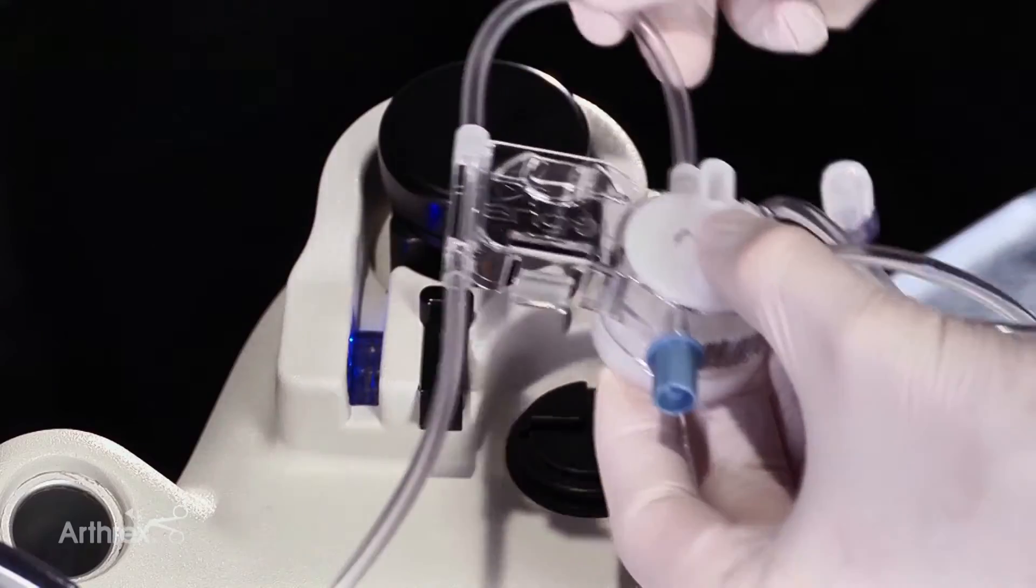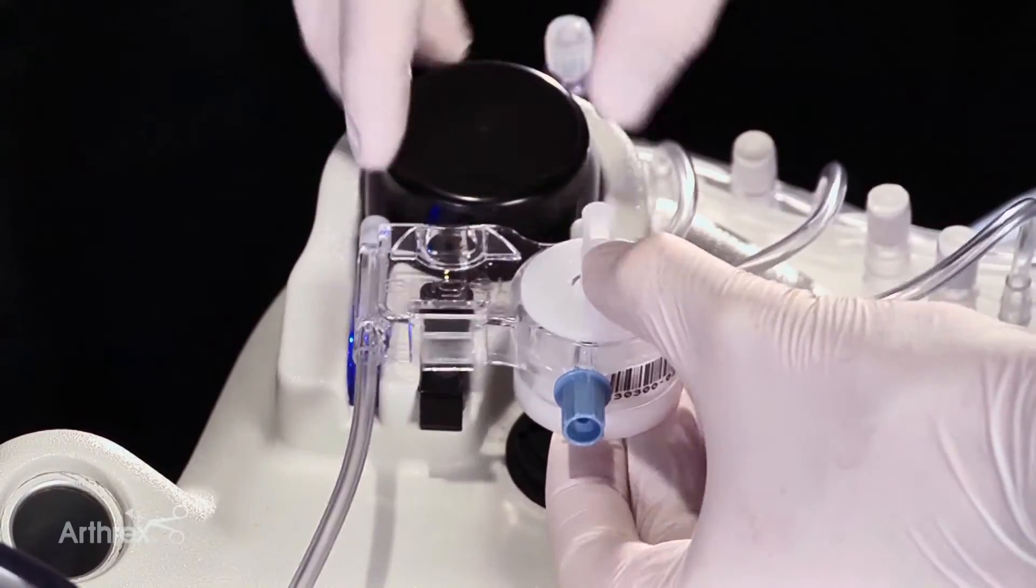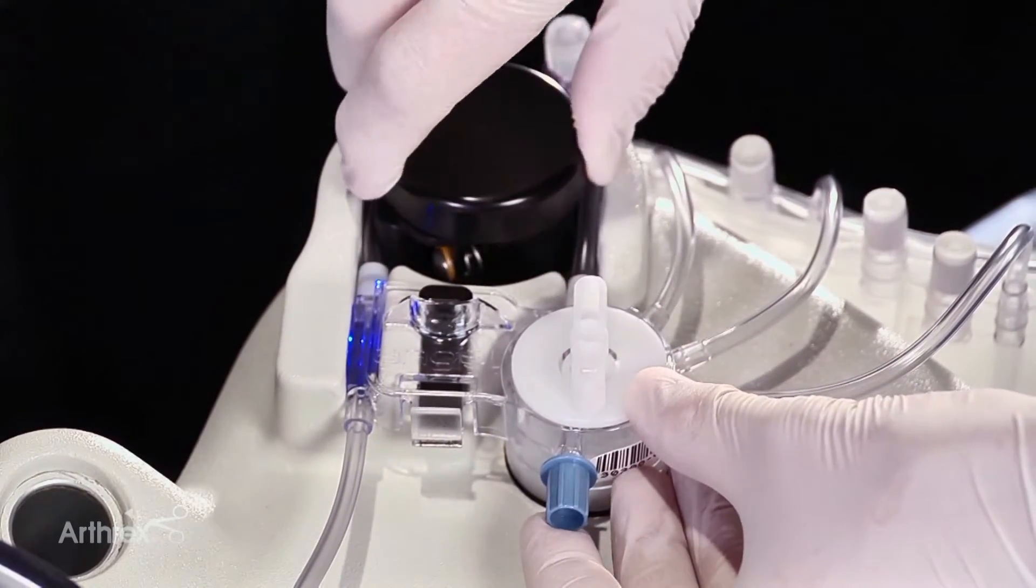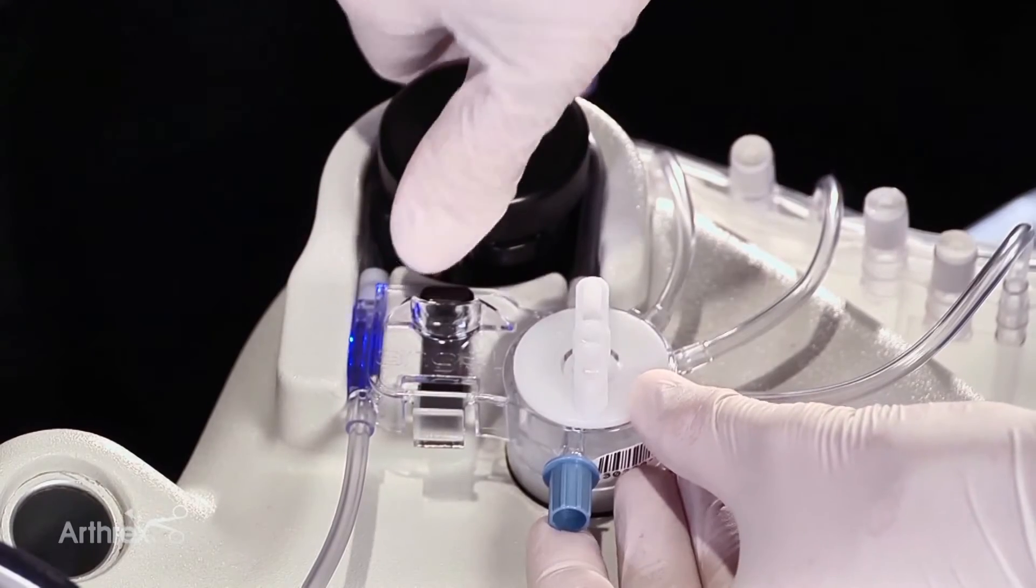Place the tubing over the pump rotor. Seat the valve assembly by aligning it with a valve driver. Press down firmly until the assembly snaps into place. Turn the pump rotor clockwise to seat the tubing.